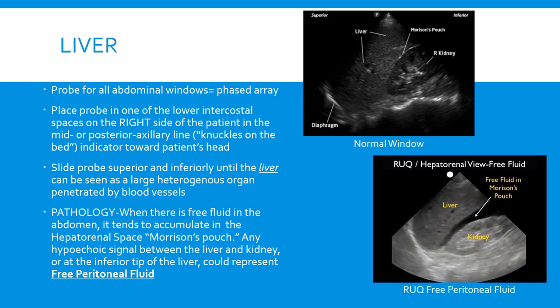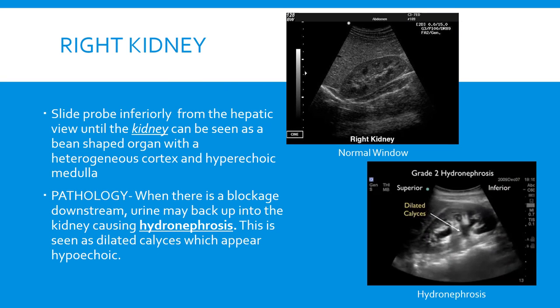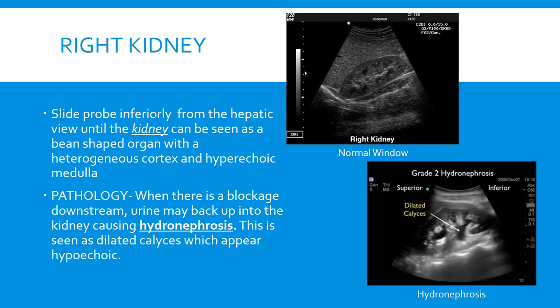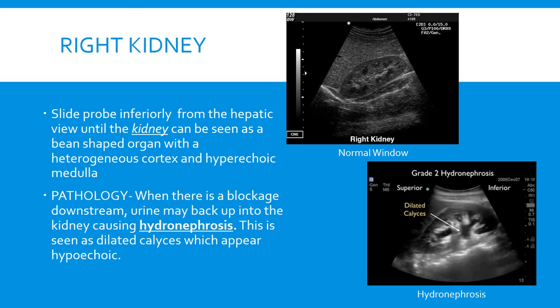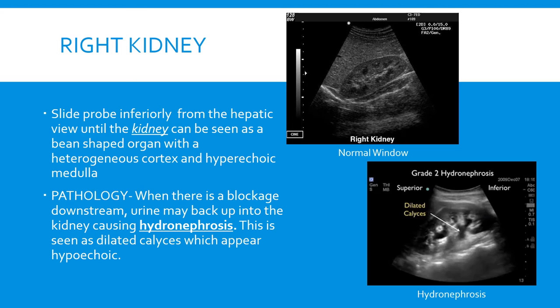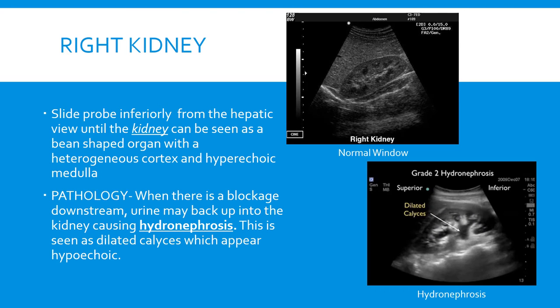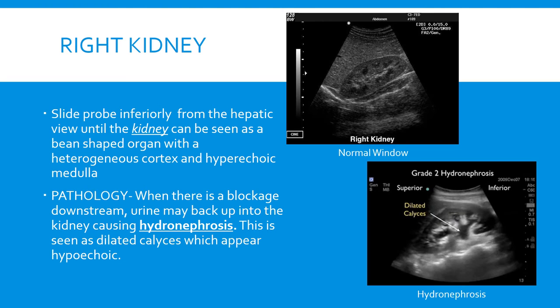This could mean the patient is internally bleeding or has any kind of free peritoneal fluid. We then slide the probe a little bit inferiorly to bring the kidney to the center of the screen. The kidney is bean-shaped, has a heterogeneous cortex, and should have a hyperechoic medulla. In a patient with hydronephrosis, fluid backs up into the kidney causing the calyces to dilate, and you'll see a hypoechoic signal in the medulla instead of a hyperechoic one.